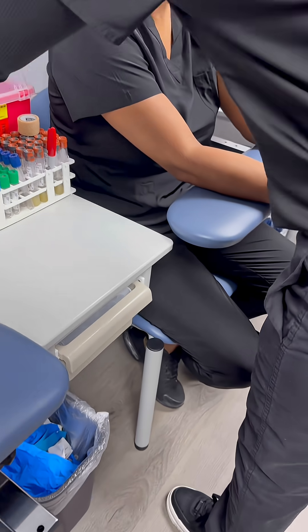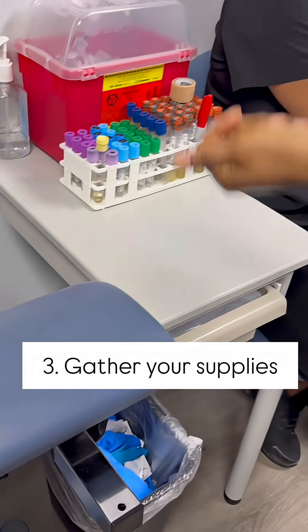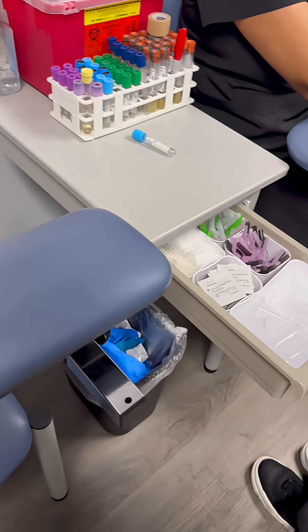Can I get your name and date of birth? As she's telling me that, I am going to sanitize my hands. Now I get my supplies — we're only doing one tube tonight, so just grab one tube.